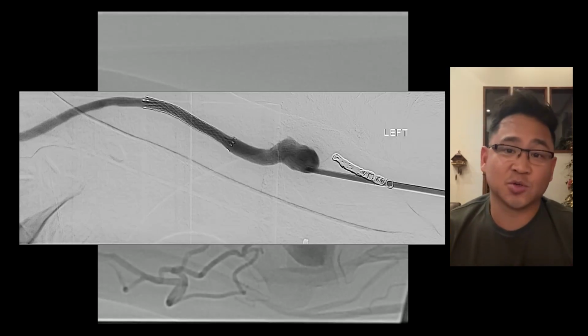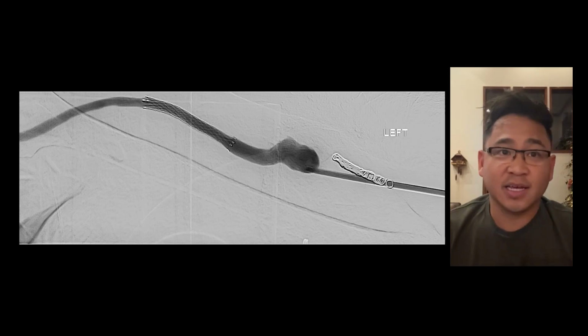And that vein we had to ultimately embolize because it was the reason why the fistula went down in the first place, but also why they thought that it was still usable because there was flow moving through the fistula, but not technically in the direction that was created. It was all coming out of these really large parasitizing vessels. So this case went from a fistulogram to a declot to an angioplasty to a stent to an embolization.